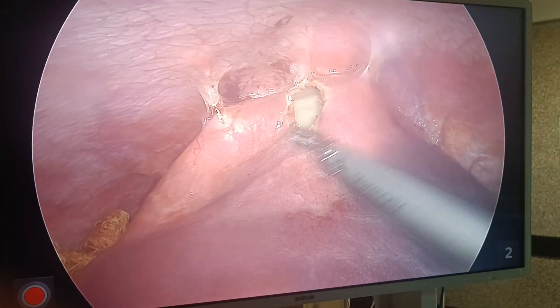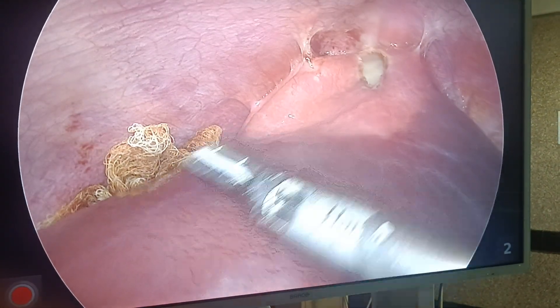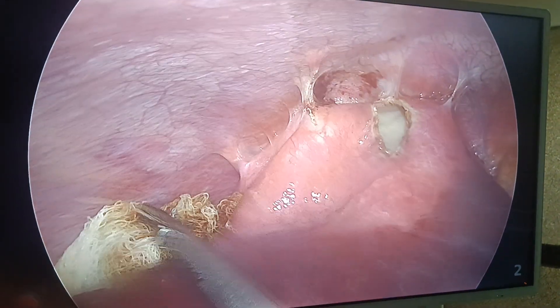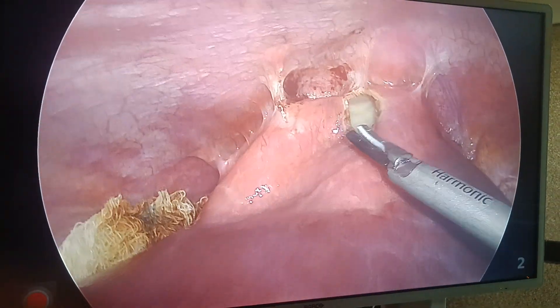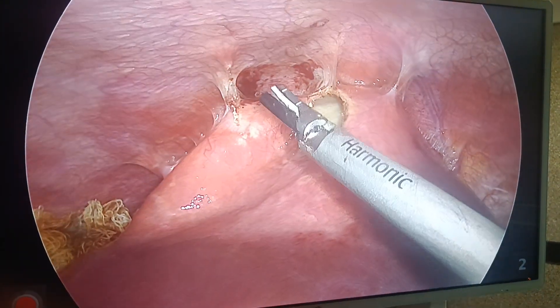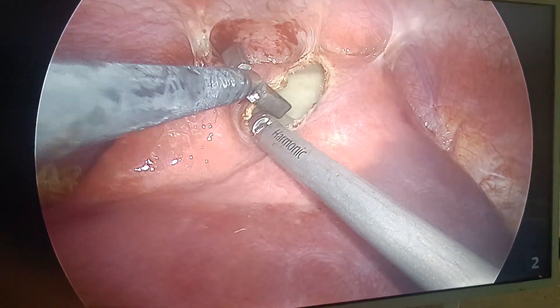Now what I am doing is laparoscopic de-roofing. This is the cyst. Can you see this is the normal liver? Can you appreciate — this pink tissue is the normal liver. I have given prophylactic albendazole and I have covered with betadine gauze pieces so that there should not be any anaphylactic reaction. I am going to remove this cyst wall and then show you the important content.